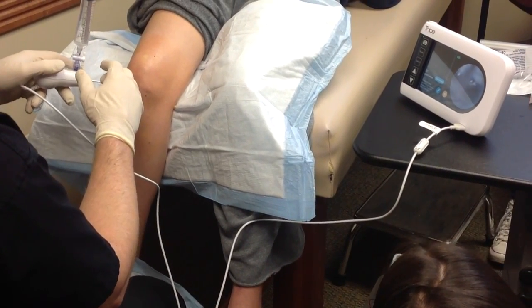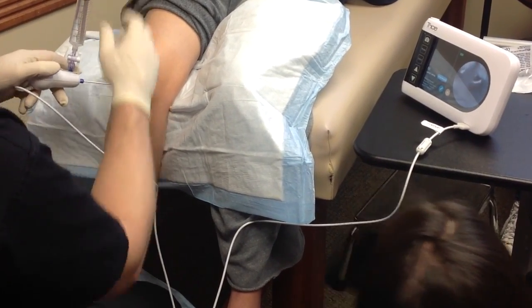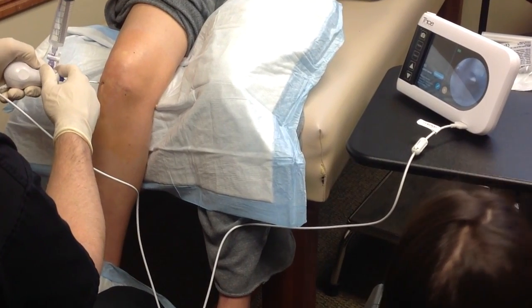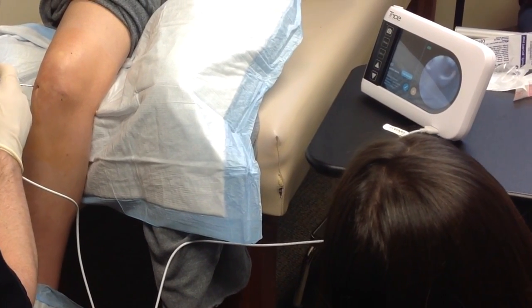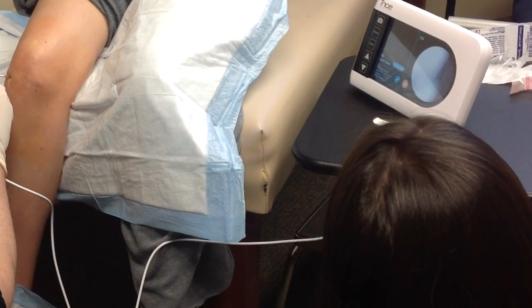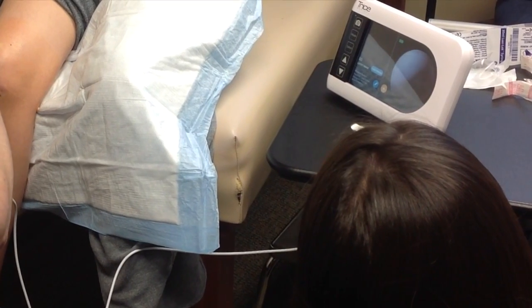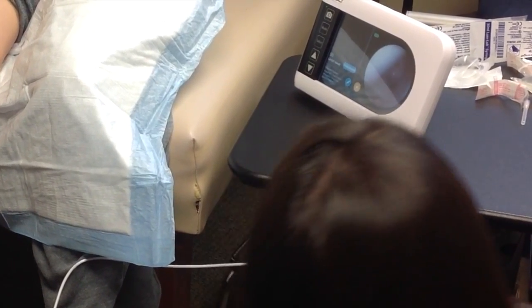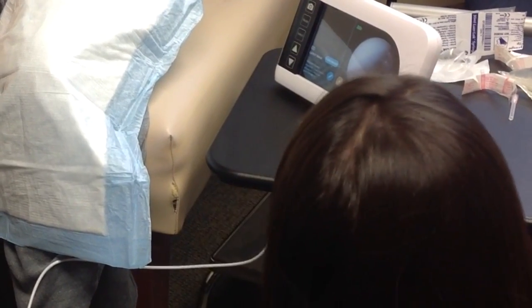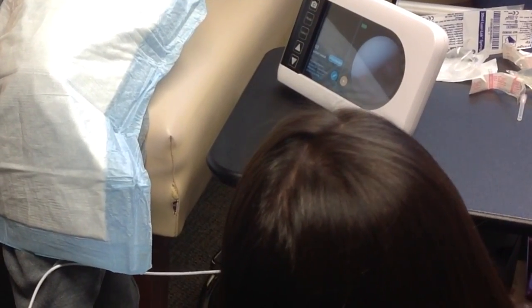Once the needle is introduced, I'll push a little bit of saline. And then with my left thumb here in the video, I will advance the camera out of the sheath. This will allow us inspection of the knee. In this case, the first structure I'm going to visualize is the anterior cruciate ligament in the center of the knee. This is my landmark, and then I'll move into the medial compartment and inspect the medial structures, and then later reposition for the lateral structures.